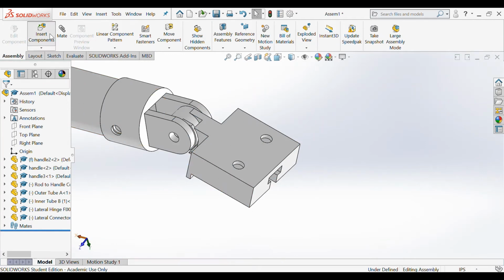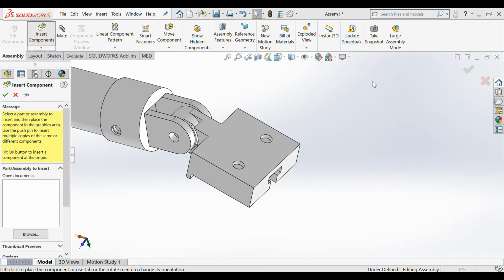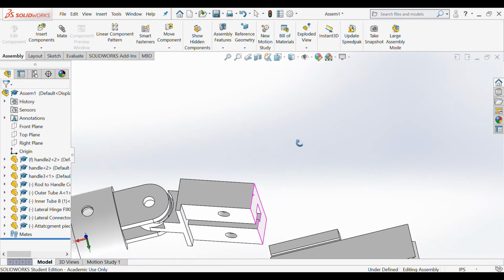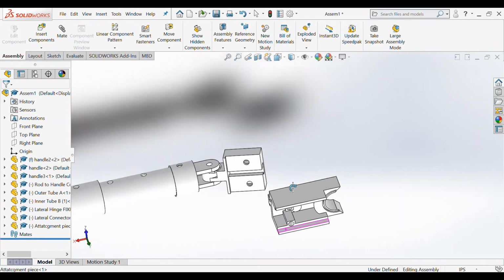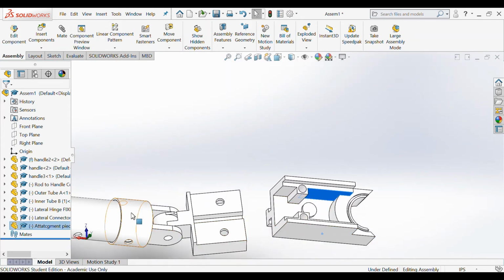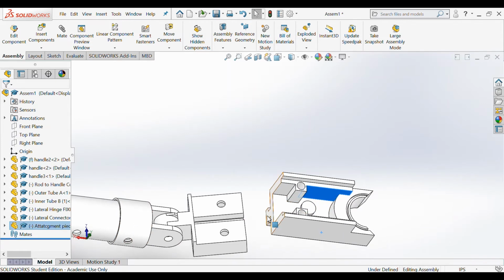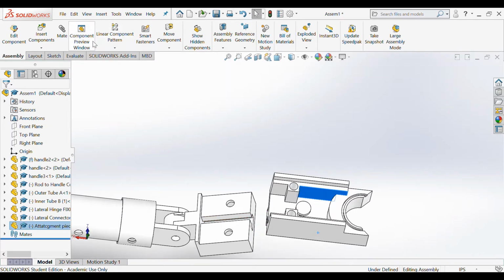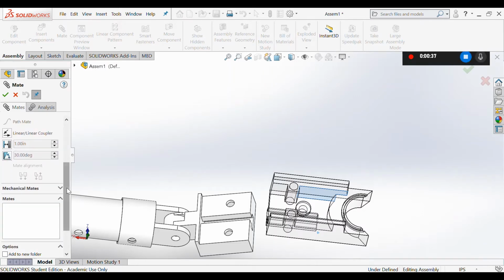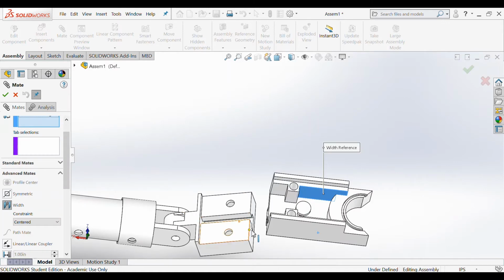Next, I'm going to insert our attachment piece. I'm going to go on ahead and click. I'm going to rotate the piece like so. I'm going to go on ahead and use another width mate to place this bottom piece into the slot right here. So we're going to go down to Advanced Mates, Width Mate.